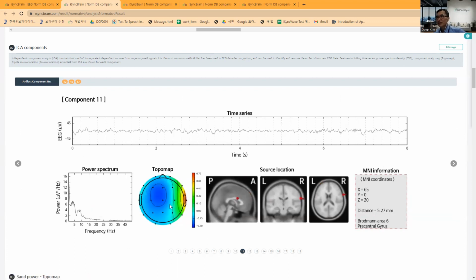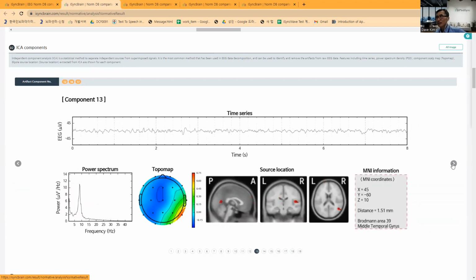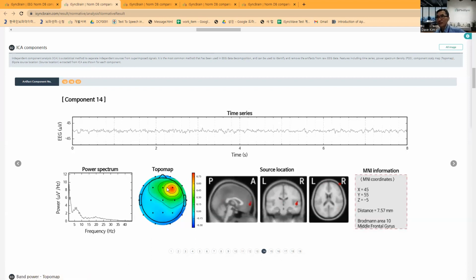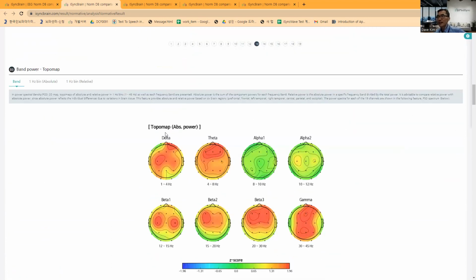Now another pre-central generated slow activity here. We can see basically a lot of central theta and SMR coupling, and a lot of theta activity in the frontal, and a lot of temporal slow alpha activity. This is her EEG, can be associated with her memory decline. Basically, slow activity is higher, and the beta activities is also higher.